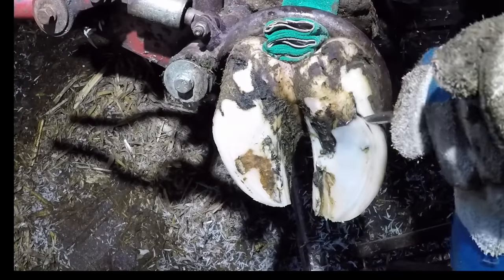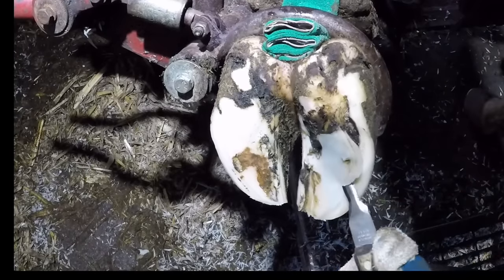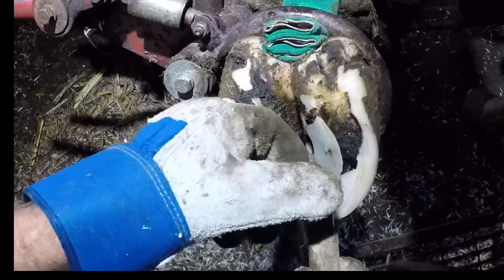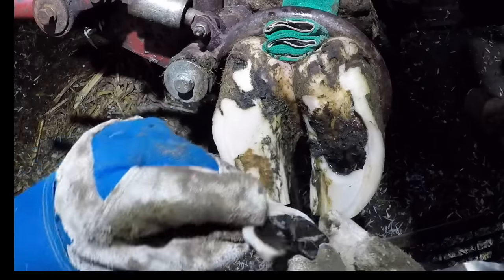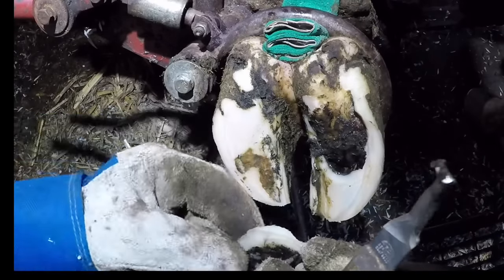How do you know how deep to go and how do you keep from cutting the live tissue underneath? We use specifically designed knives that have a hook on the very end that allows me to hook that hoof and pull away as I cut. I'm able to remove these large chunks of hoof without damaging the underlying corium, or in this case a lesion that is protruding from that sole.